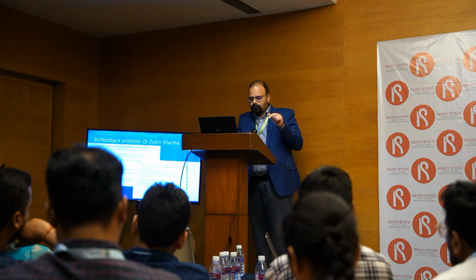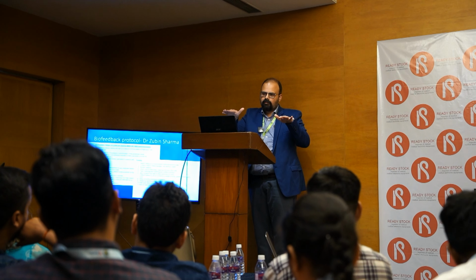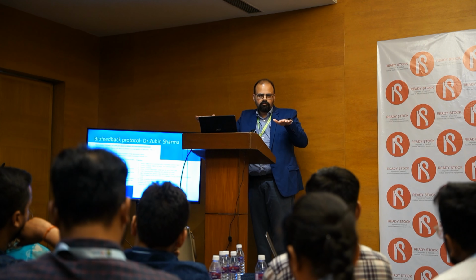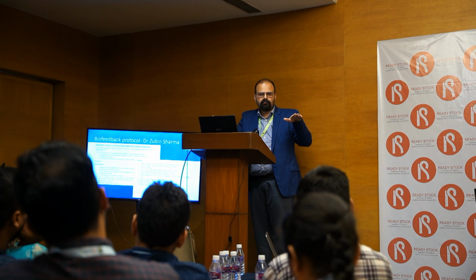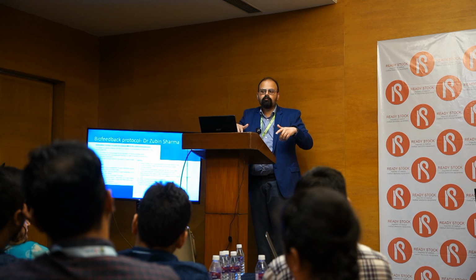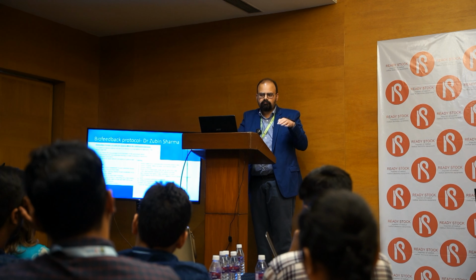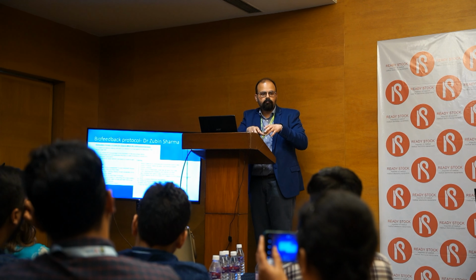So you have to make sure your patient has learned these two techniques well: abdominal breathing, or diaphragmatic breathing, and squeeze relax. Once they have mastered these two things, which will take 3 or 4 sessions, only then can you proceed to coordinate these together and train them on a push technique.